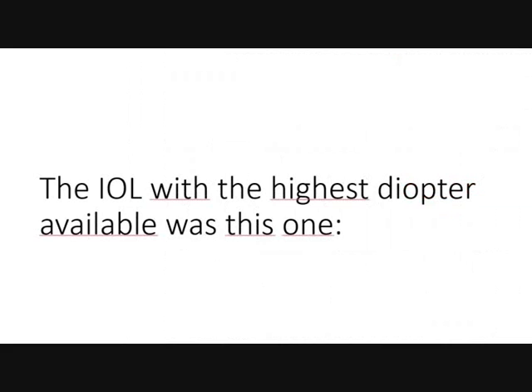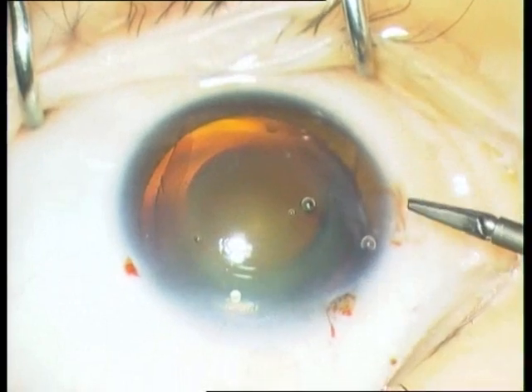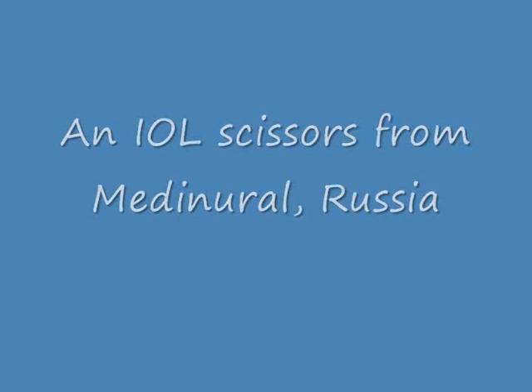Well, the IOL with the highest diopter available was this one. This is from Alcon, an IOL with 40 diopters. There was nothing else available. So now we come to the surgery.